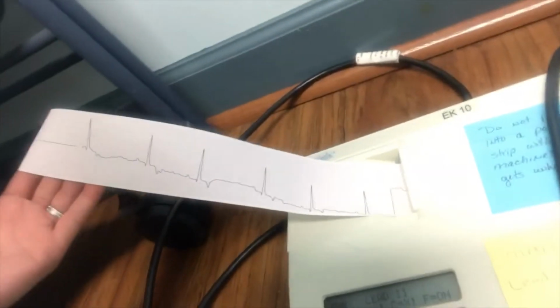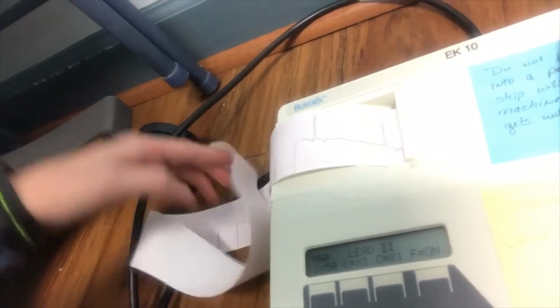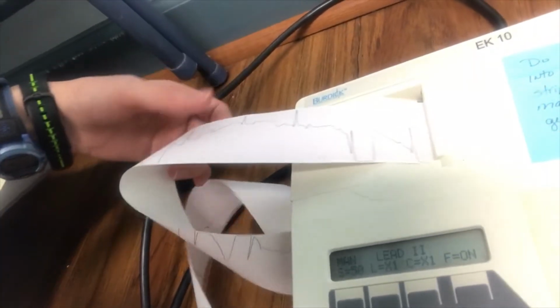Oops. There we go. Alright, so now our lead is tracing. We'll let it run for a good solid bit here, that way we have plenty of seconds to compare. We are getting a little bit of artifacts there, so I'm actually going to pause it and see if I can make adjustments to help prevent artifacts.